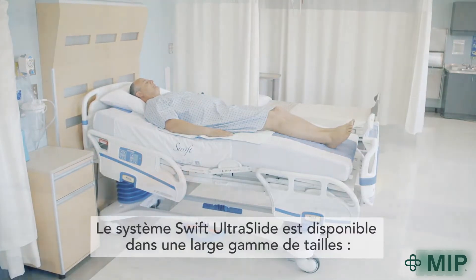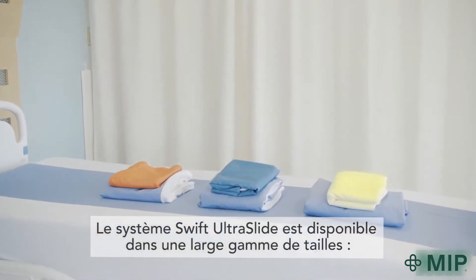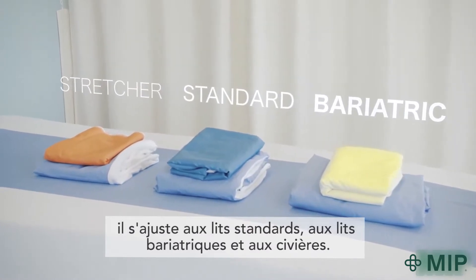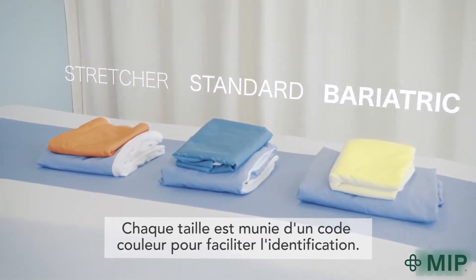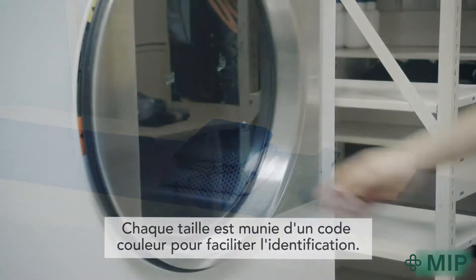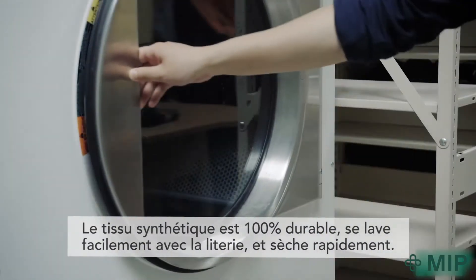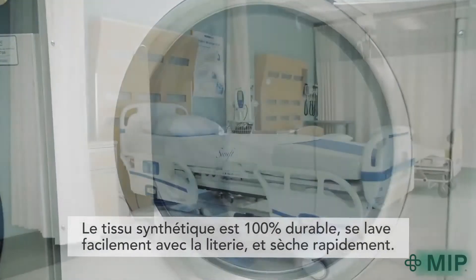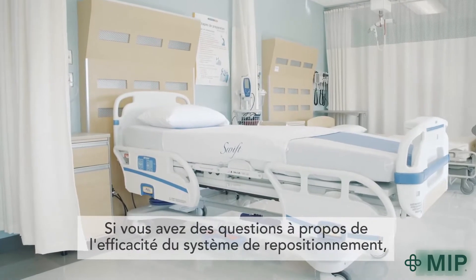The Swift Ultraslide system is available in an array of healthcare mattress sizes for standard beds, stretchers and bariatric beds. Each size is color coded for easier identification. The durable 100% synthetic fabrics are easily laundered with other bed linens and dry quickly.